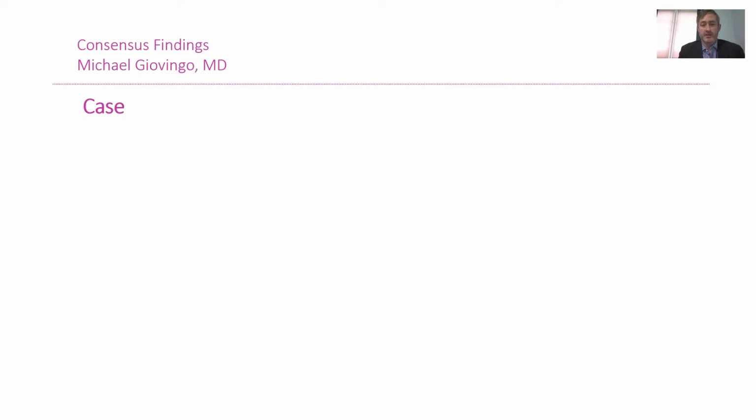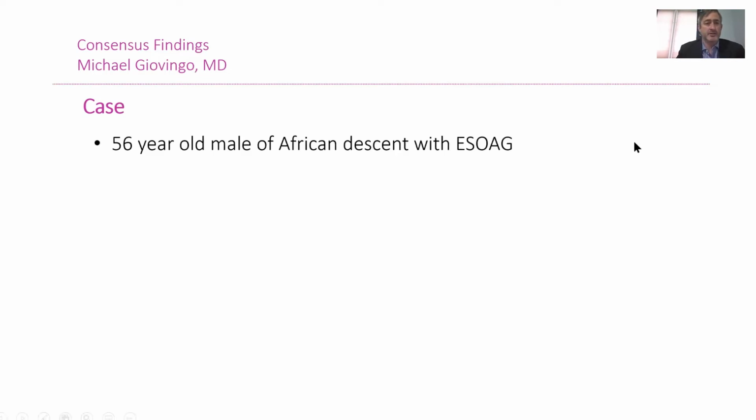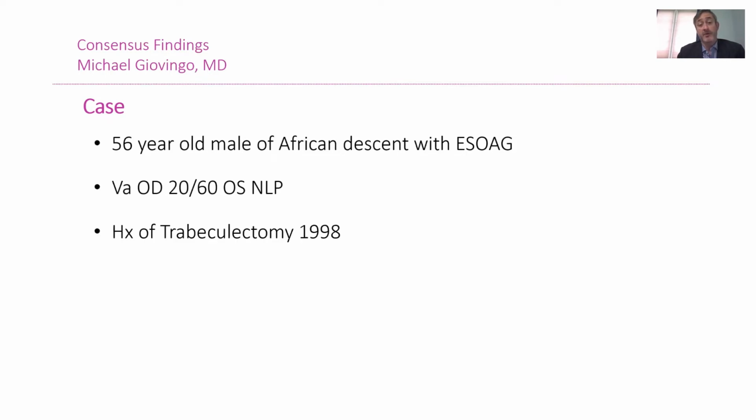This case is a 56-year-old patient of mine of African-American descent with end-stage open angle glaucoma, probably juvenile onset given the age. The patient's right eye is 20/60 best corrected. The left eye has been NLP for a very long time from glaucoma.